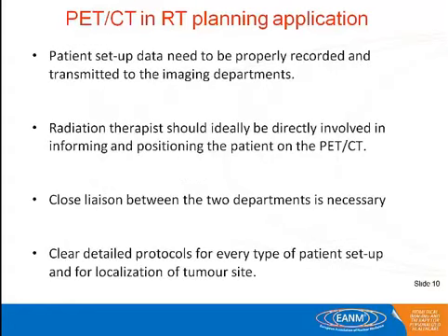We need to record setup data. So people say, okay, we plan it this way, and they have to record really accurately. The ideal situation is having a radiation therapist involved in the patient in an imaging capacity. We really need a close liaison between the two departments and clear, detailed protocols for every type of patient setup, for localization and for localization of the tumor site.